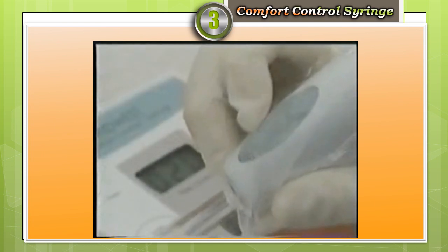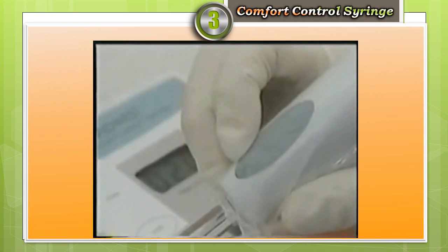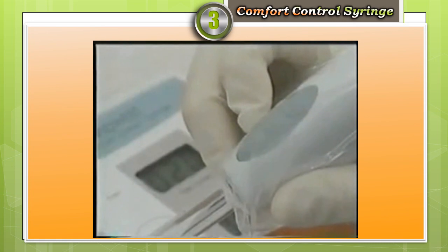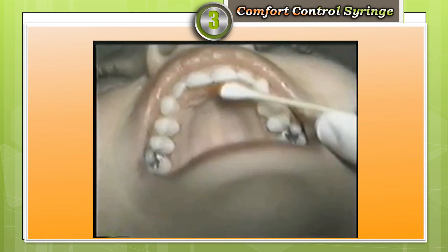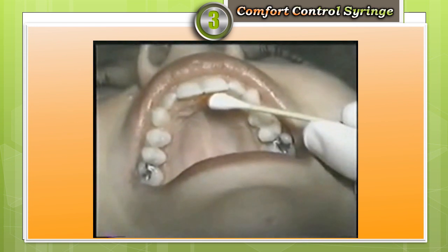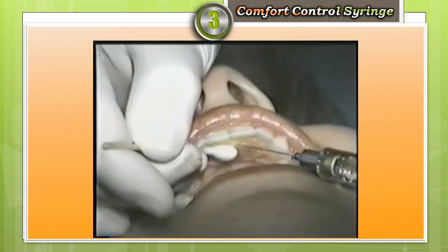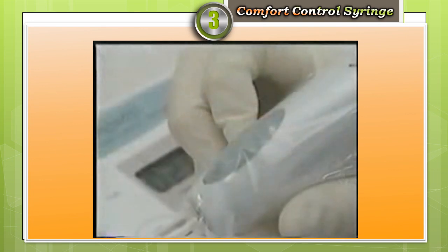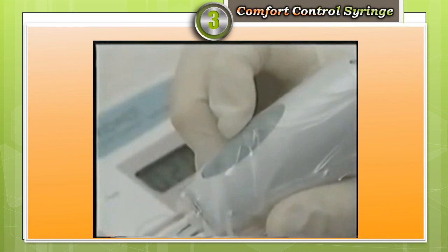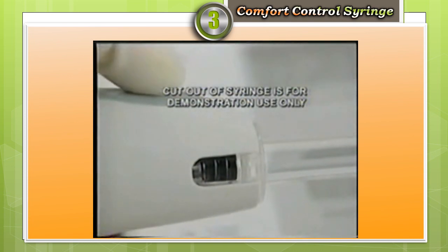Press the start button. Once you see liquid drops at the needle tip, press the stop button on the handpiece. The needle has been cleared of air. You do not need to alter your chosen standard techniques for positioning or preparation of the site when using the CCS. As with your traditional syringe, position the needle at the site and slowly insert. If the chosen injection requires aspiration, press the aspirate button. The plunger will retract a short distance.